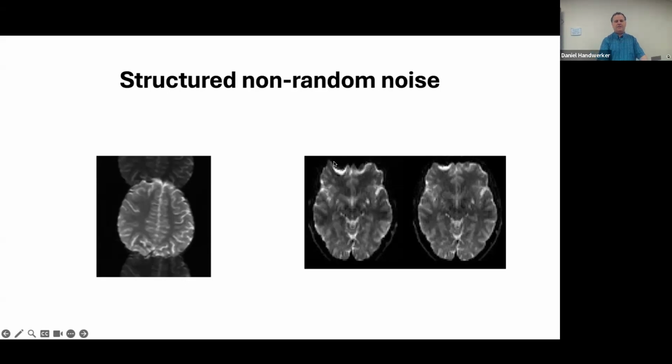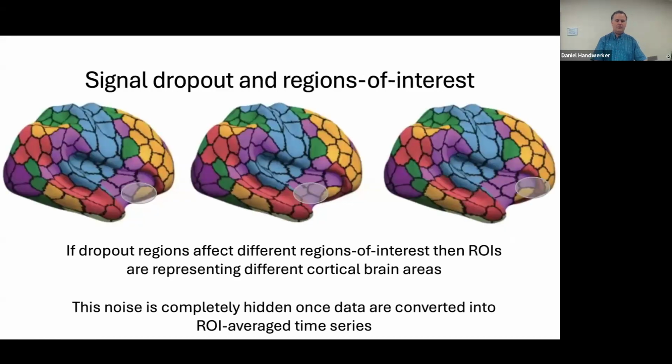And this is an example of distortion and dropout. Here the brain is a little bit distorted, and here's an area of the brain that just doesn't exist anymore. Pretty much all fMRI has dropout. So depending on what areas you're looking at, you're going to want to assess where the dropout is, and how important that is to what you're doing.